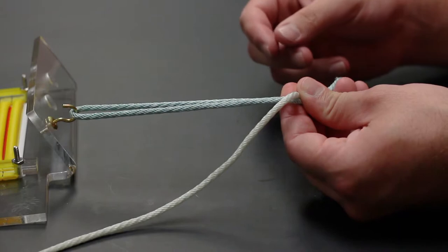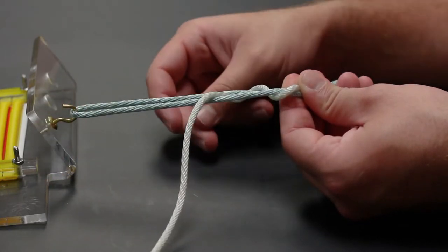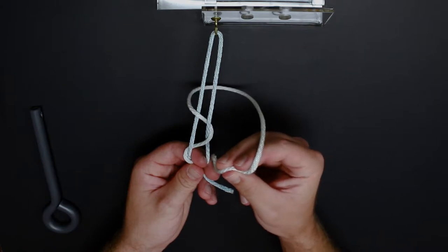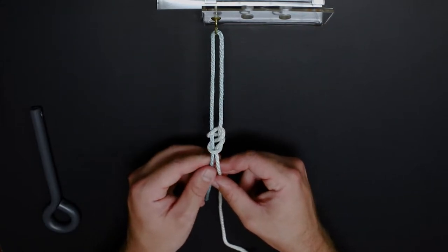We then go over the top of the post limb, under the post limb, over the loop limb, under the loop limb, over the post limb, and then under both limbs of suture. The suture is then passed through the initial loop that was created, and the knot has been created.